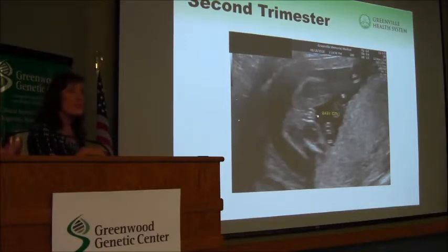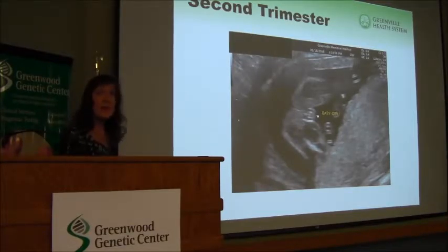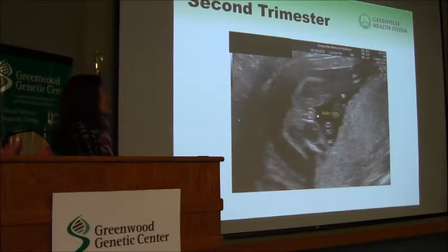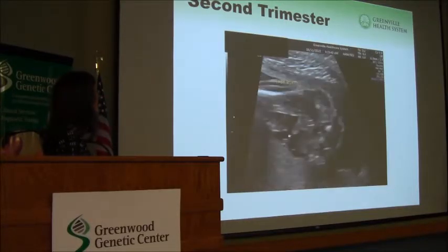But there are certain birth defects associated with sex-linked genetic conditions, and so sometimes it's really important to know, is this a boy baby or a girl baby? Because I might have invasive testing, an amniocentesis or a CVS, to look for something if it's a male fetus. So the genitalia is not only important to parents, but it's important for us when we're assessing risk for birth defects. So this is the little pornographic picture of a little boy.